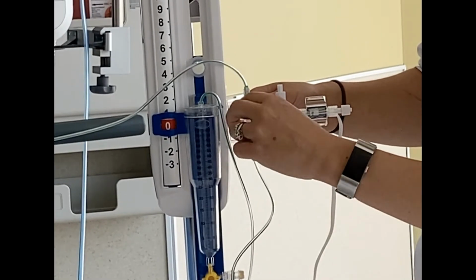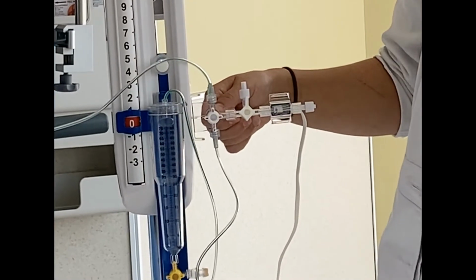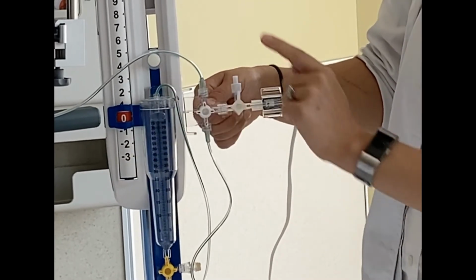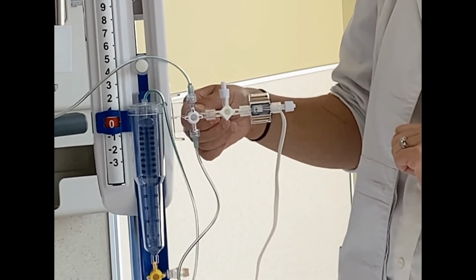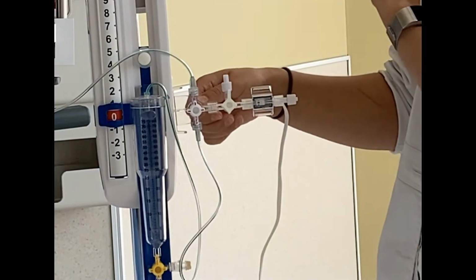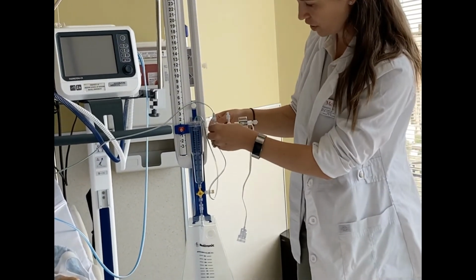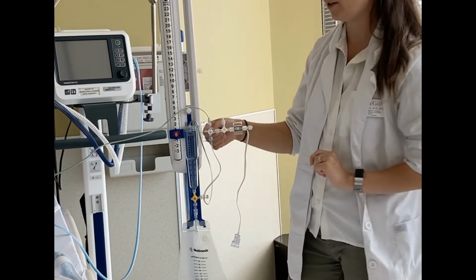So what I'm going to do is I'm going to do this. So right now, the CSF can still come here. It does not drain into the chamber, but my transducer can still sense it. Once I am done measuring my ICP, because I will be looking at the monitor and reading out the ICP value and recording it in the patient's chart, I can reopen the system again so that it's open 3 ways.